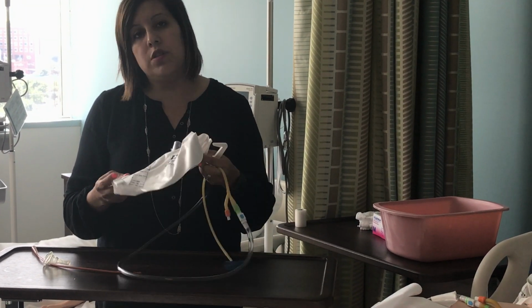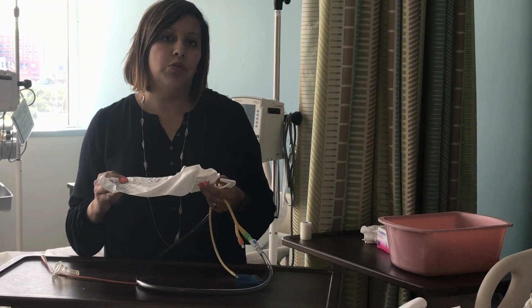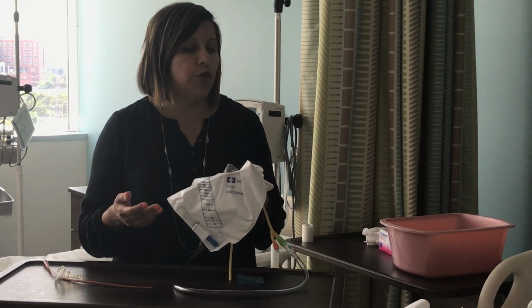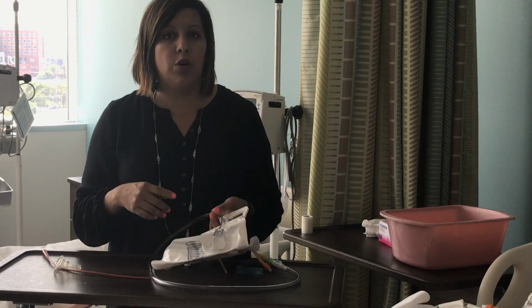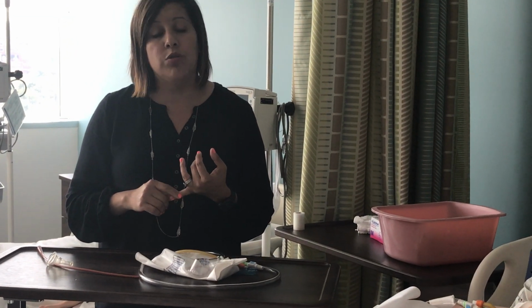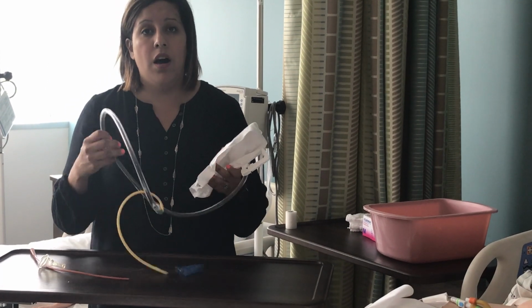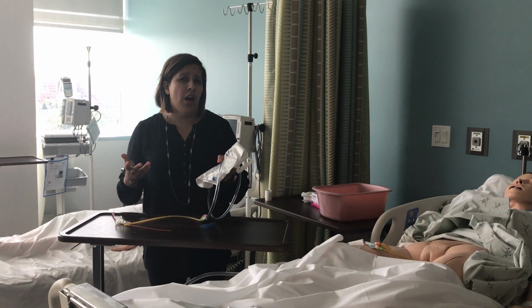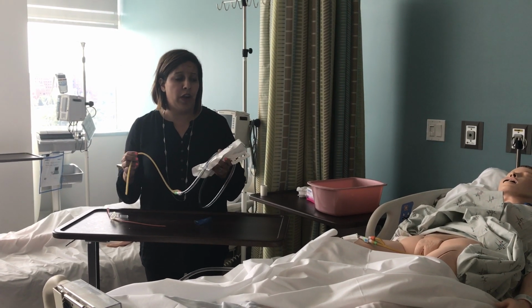The reason they use this is usually before, during, and after surgery. They also use this if a patient is not able to go to the toilet or can't go to the bedside commode, sometimes due to weakness or because they may be disabled. So this may be an indication of why they have a catheter. Normally they don't have it just for incontinence, because this increases the risk of infection.